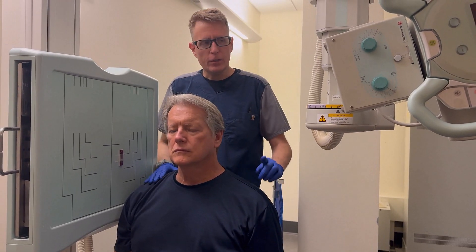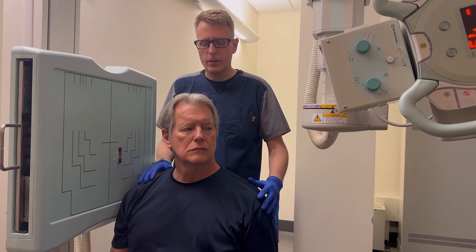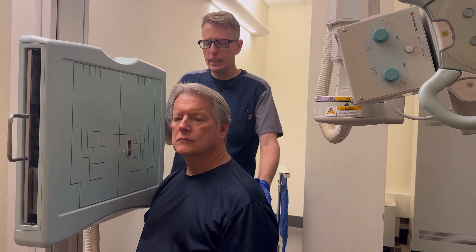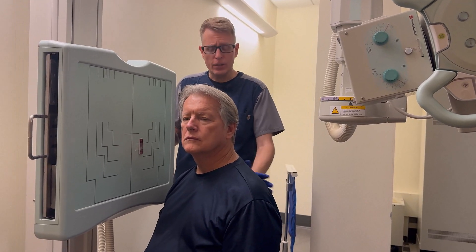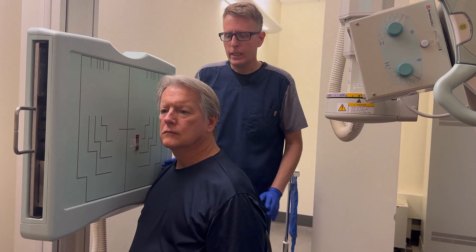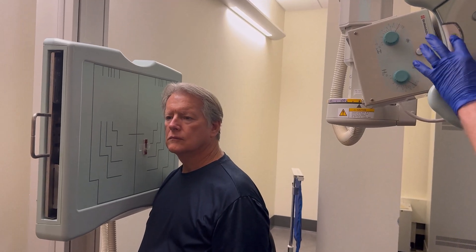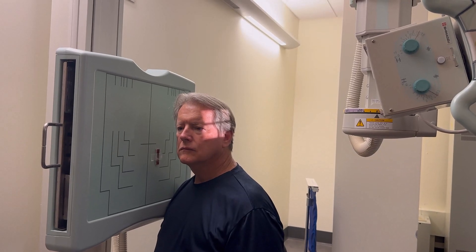I'm going to have my patient turn his head toward the tube first — so that's turning to the left. Then we're going to rotate the shoulders just on this chair to try to get a little less OID, but we don't want any tilt. We can try to have you scoot in a little bit and look straight ahead. So I'm first going for a true lateral as if I were shooting the Schuller method.